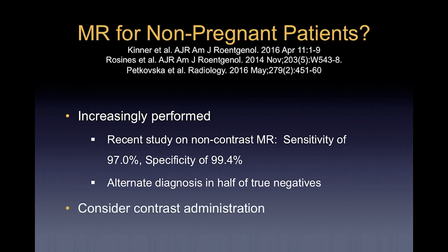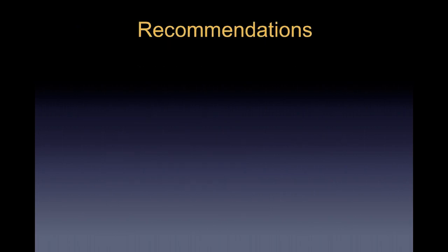And if the patient isn't pregnant, you can consider giving contrast and have all of the benefits of looking for the appendiceal wall hyperemia and such.